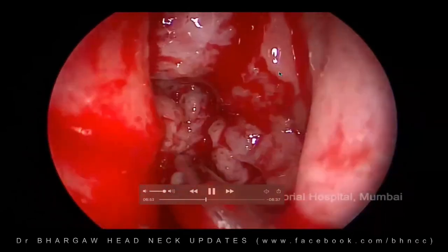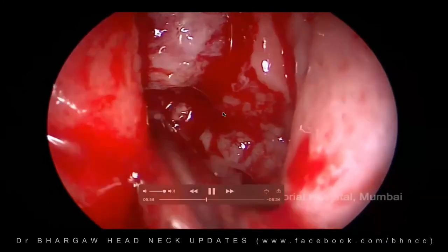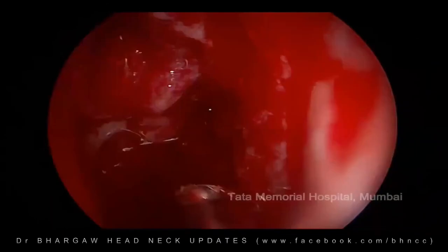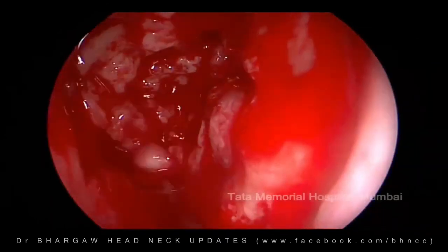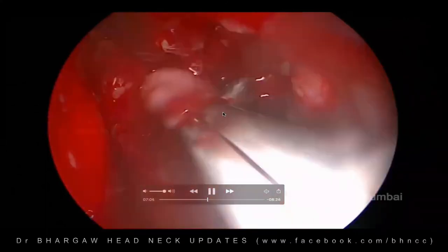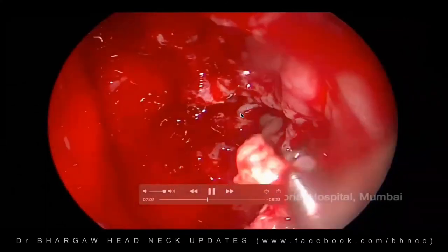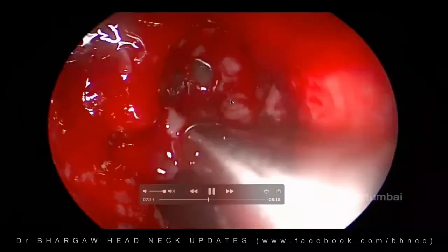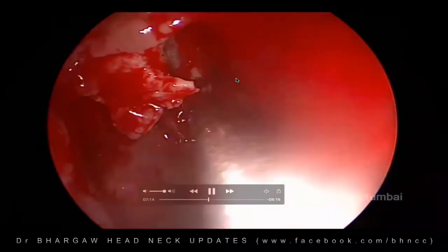It's post NACT, so it's very oozy. It was the case in the previous video as well, so kindly bear with me for that. So we're just debulking the tumor to see where exactly it is originating from, to look at the landmarks here, because essentially you can appreciate that there's no landmark that is being seen here.